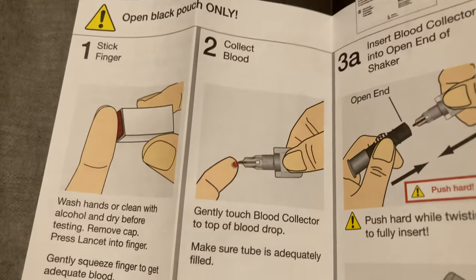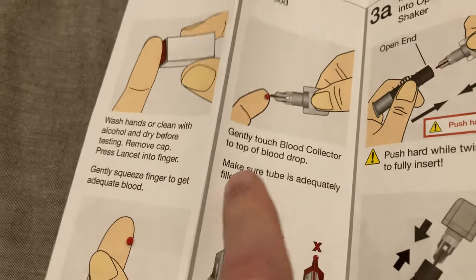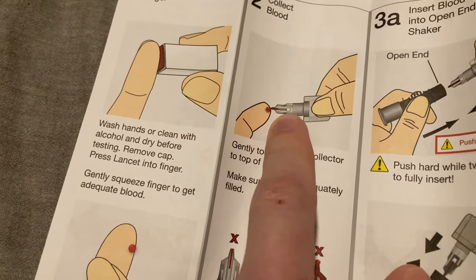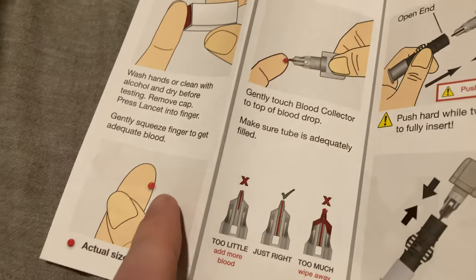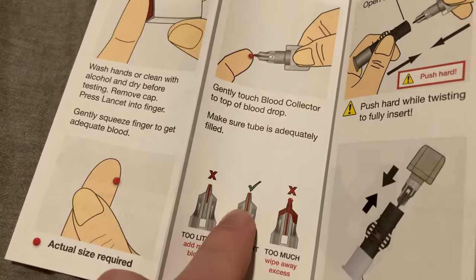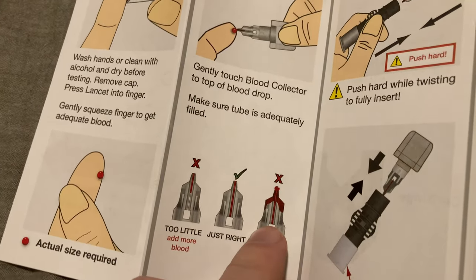Okay, after that, you're going to collect your blood in this collector. And you're going to touch the end, and capillary action inside this evacuation tube in the middle of the collector is going to suck the blood off the droplet off your finger into the tube. Now, you want it to fill the tube. You don't want it halfway full, and you don't want to put blood all over the end of the tube.